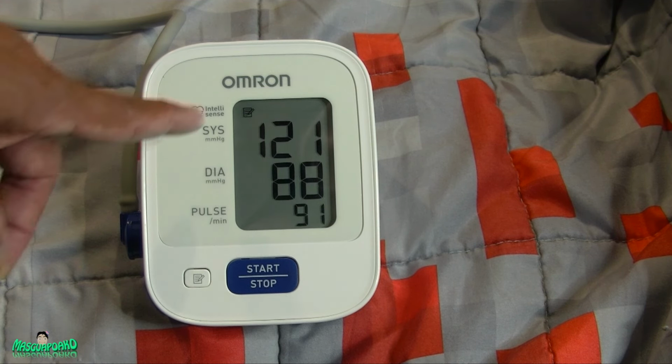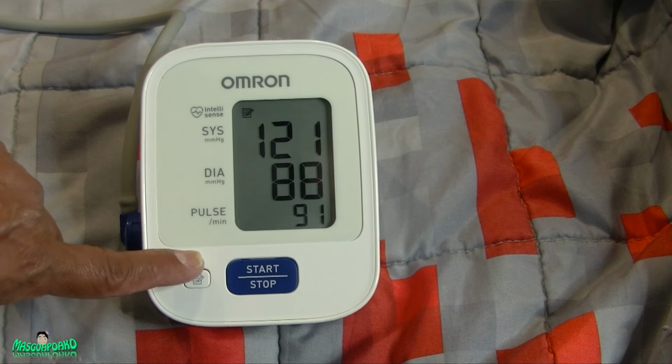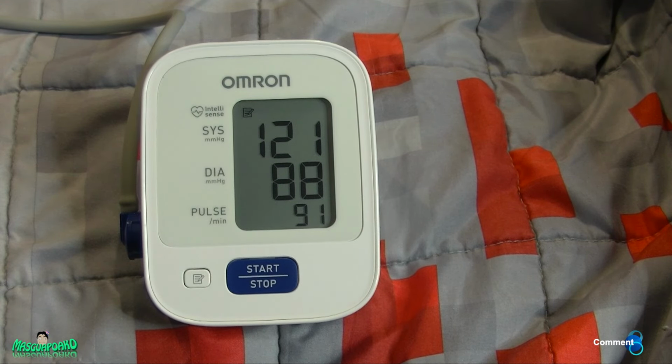Here is an Omron Series 3 blood pressure monitor, and in this episode I'm going to show you how to erase the saved memory of all the readings that you had. This is all the readings, and I'll show you the readings.